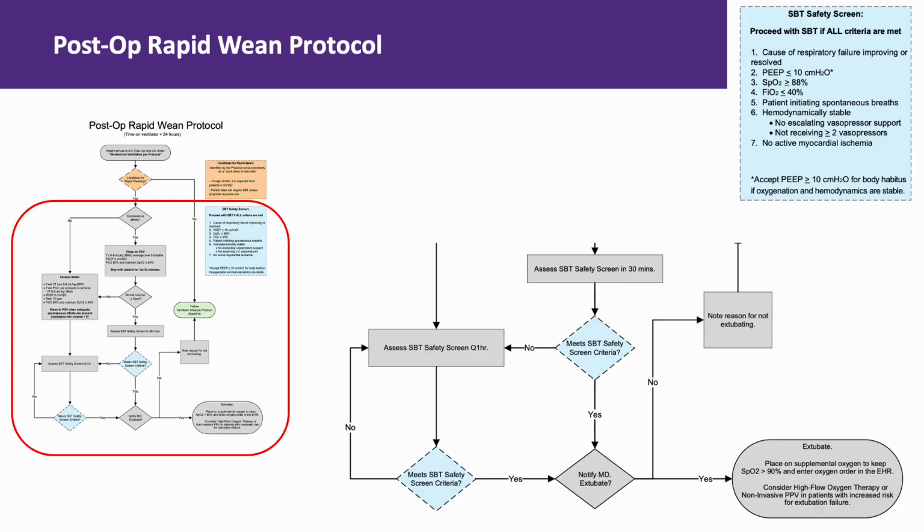Always have your post-extubation plan ready before you pull the tube. Know what supplemental oxygen device you're going to use, have suction available, and be prepared in case the patient needs reintubation. Safety first, as always.